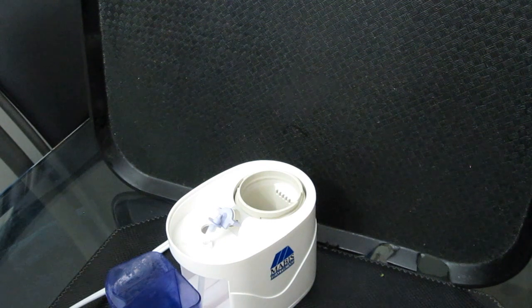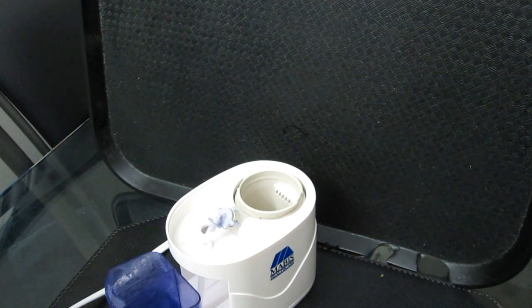I also recommend putting, to the effect that it does work, I keep a box of tissues next to me so I don't have to keep getting up, because it does, after 4 or 5 minutes into it, you do want to blow your nose. Remember not to pinch too hard, or else you're going to back things up and make your problem worse. But that is a little trick.